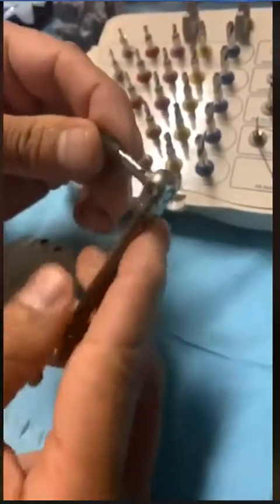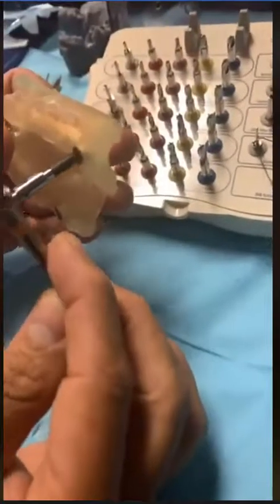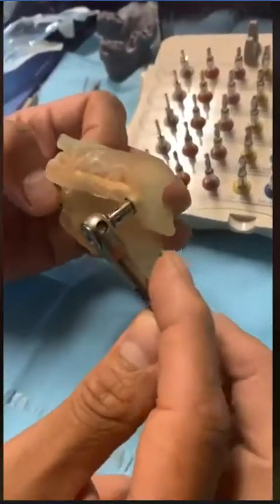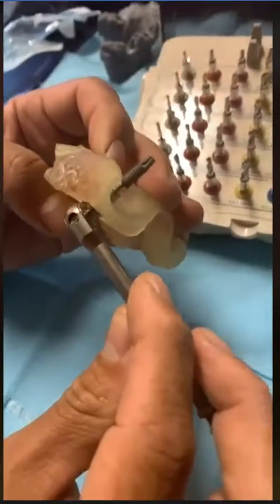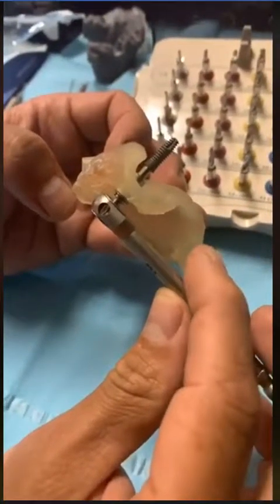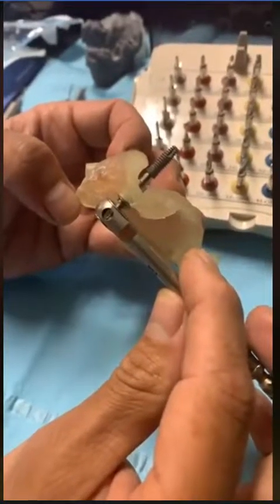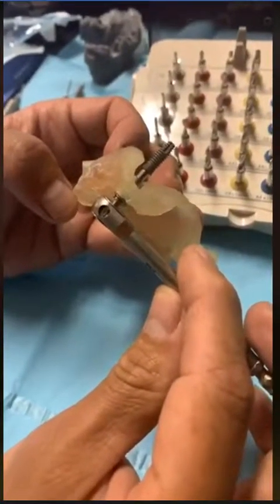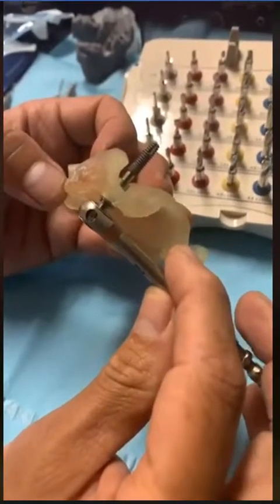Now, this system allows you to insert your implant with this carrying tool, okay? So that's the beauty of it, that you can actually be fully guided. That means fully placing even the implant through the guide without removing it, okay? So that's the beauty of it.